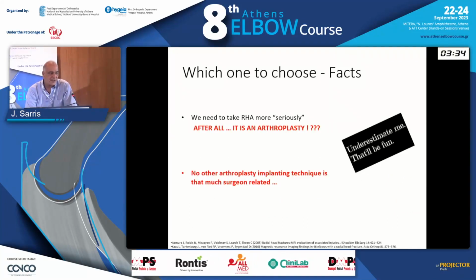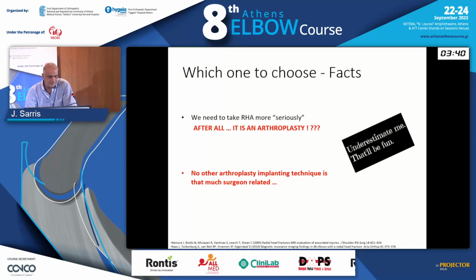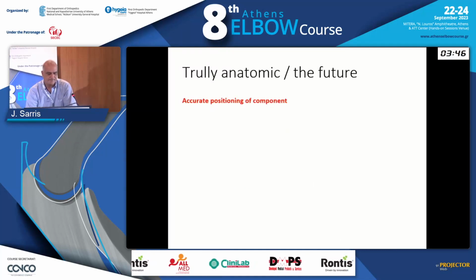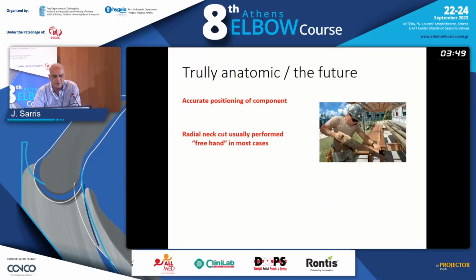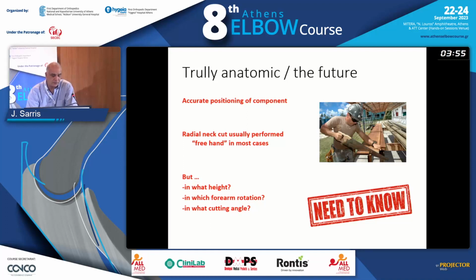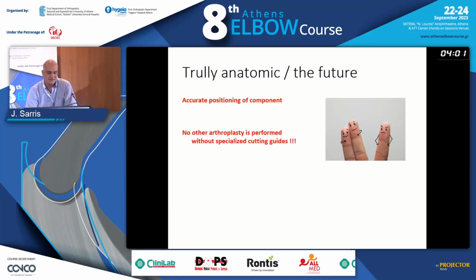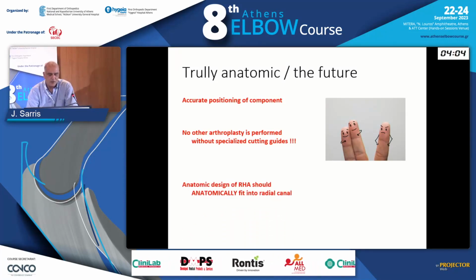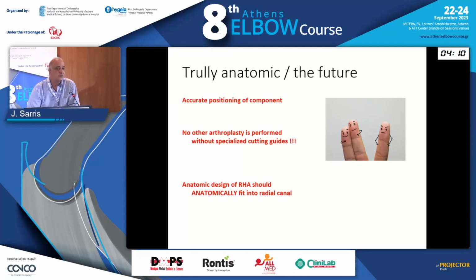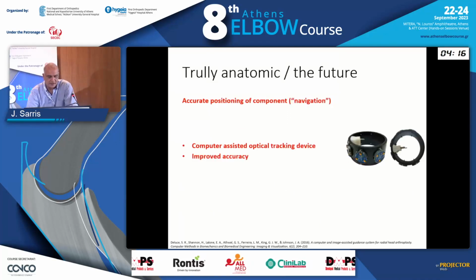And we need to take radial head arthroplasty more seriously, if we're going to use it and not just use a spacer. After all, it's an arthroplasty. No other arthroplasty implanting technique is that much surgeon-related. The radial head cut is usually performed freehand in most cases. But at what height, in which forearm rotation, at what cutting angle? No other arthroplasty is performed without specialized cutting guides. The anatomic design of radial head arthroplasty should anatomically fit into the radial canal and not just put a stem in the canal. Special cutting guides should be designed and commercialized.